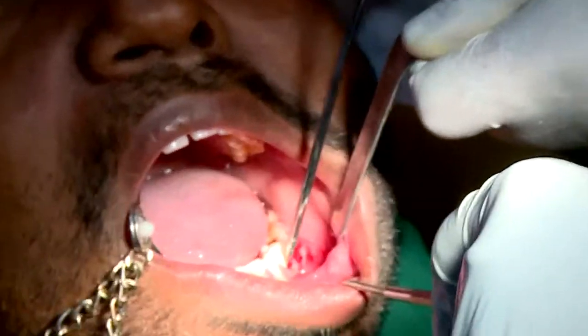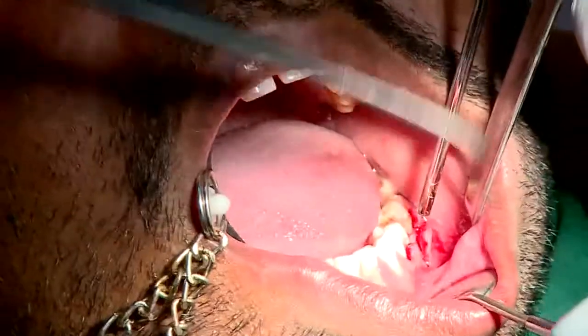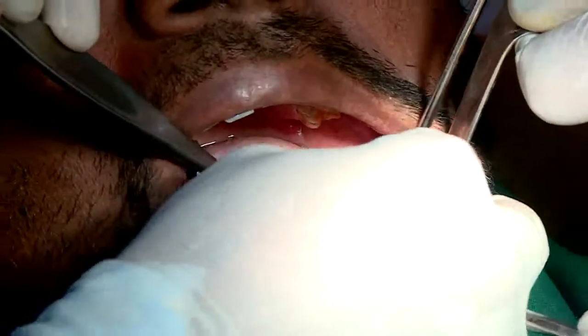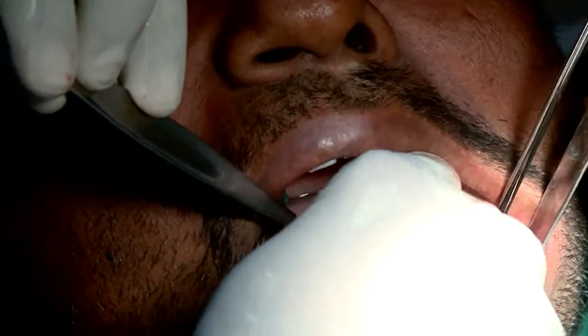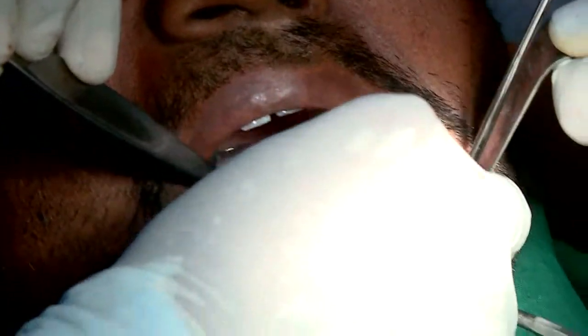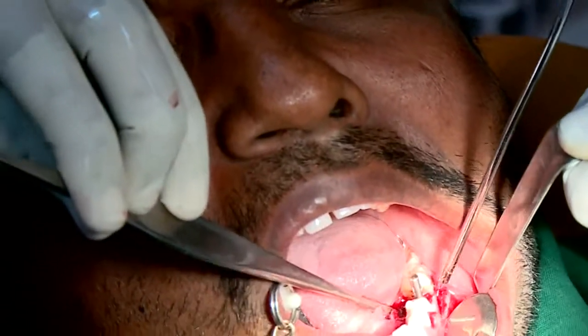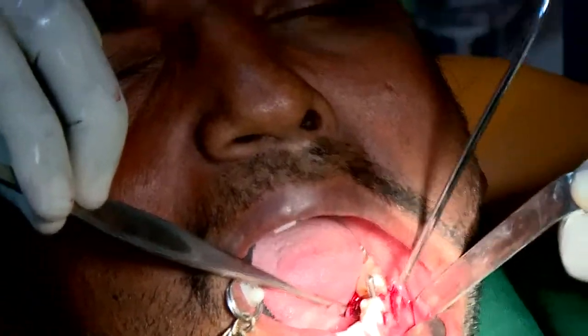Yes, sir. What we will also do right now is place a paralleling pin. Of course, we are only going to place one implant here, but it will give us a direction of where our implant is going. Now you can see this is where my socket is. Can you see that instrument? Yes.